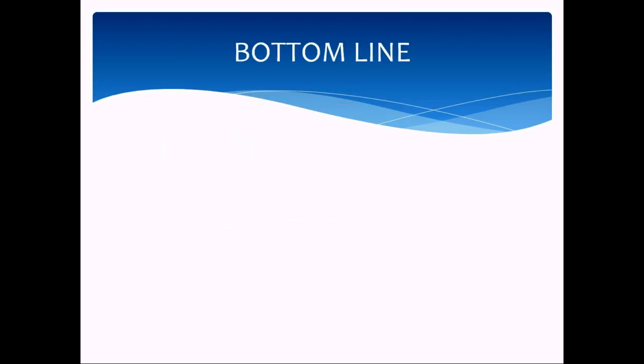Same thing here, where you've actually got some responses, but they're down at profound. And this one's interesting because this one is not outside the realm of possibility. If you were using inserts, where you're expecting a shadow curve, as an example, to be about 60, 65, 70 dB, you're sort of close to that. So this might actually be a shadow curve. Or they might not be honest about their hearing. So this is another case where masking is really, really important, so that you know whether or not this is a shadow curve, or whether these are actually true right ear thresholds.